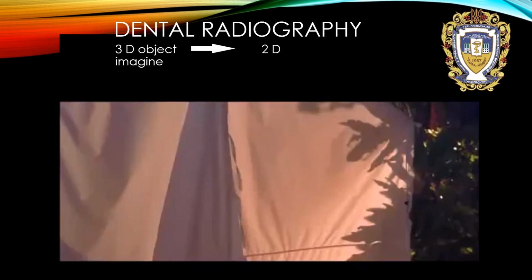Once again, doctors, intraoral radiography is only two-dimensional. What does it mean? It means that a three-dimensional object is looking like two-dimensional imaging.